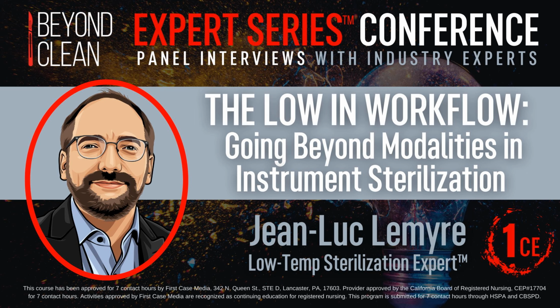Yeah, right now, and that's fairly fresh, AAMI ST91 on reprocessing of flexible scope and semi-rigid scope in the healthcare facility just came out. And I think it's a very hot topic right now. I've been involved in the working group, and a lot of the very interesting discussion within the group was like 2-3 years ago, but now that it's out, it's a topic in the field. I'm not spending a lot of time in SPD myself, being an R&D guy, but I did spend a lot of time discussing with our clinical specialists how can we, as an industry, help users make that transition from high-level disinfection of some scope models to sterilization of endoscopes.